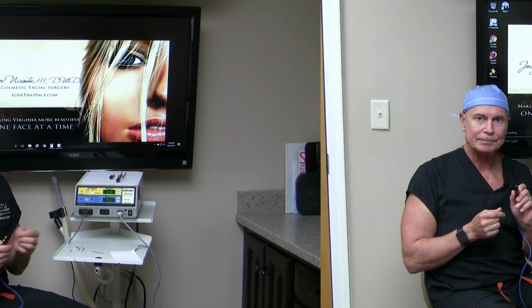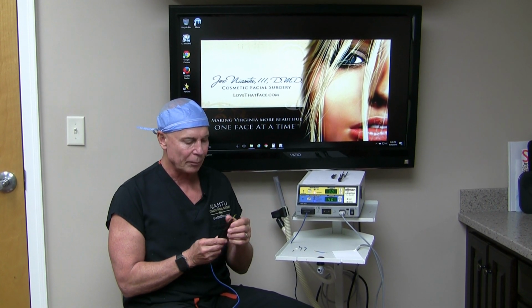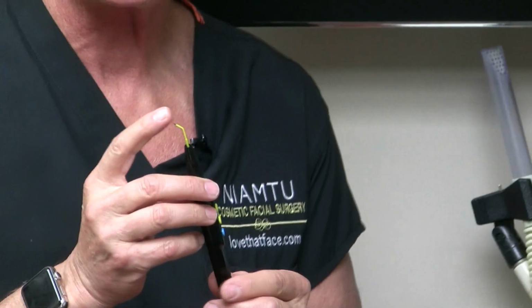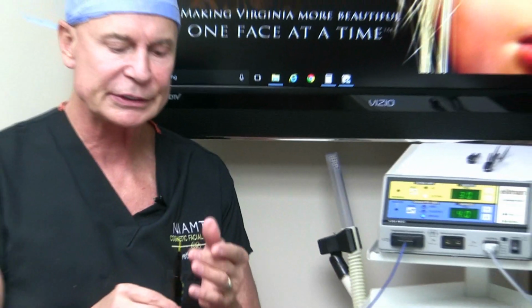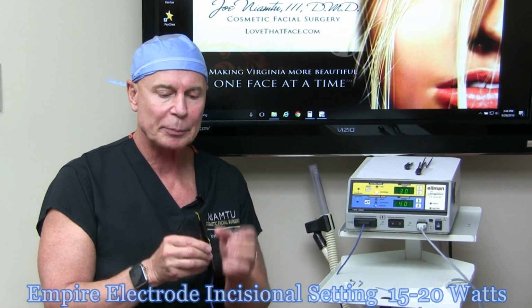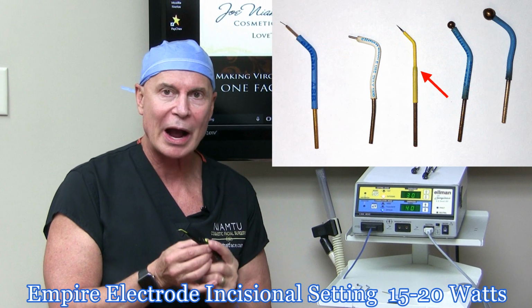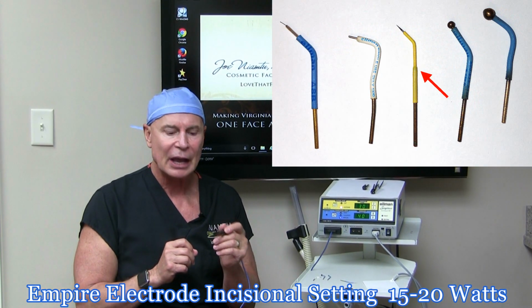Right, so as we continue, the next most common electrode I'd say is the Ellman Cynosure's Empire electrode. And this is really the same thing as the Colorado microneedle that a lot of people use. It's a tungsten electrode with a very fine tip, but it's like a cone, and it gets wider. So you can use this for eyelids and skin incisions.